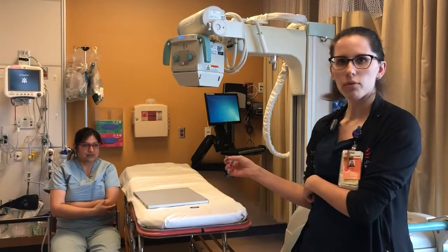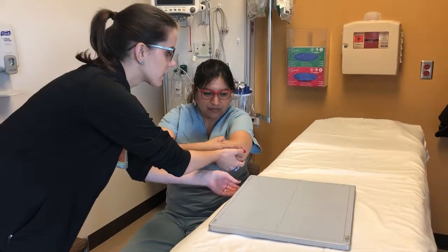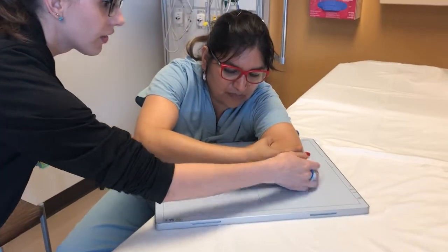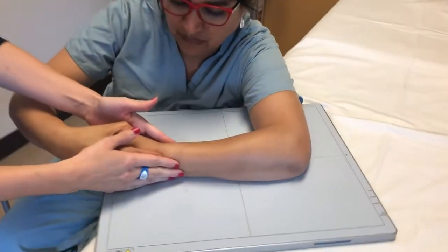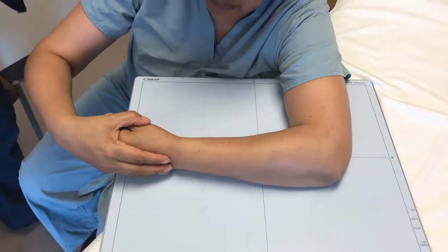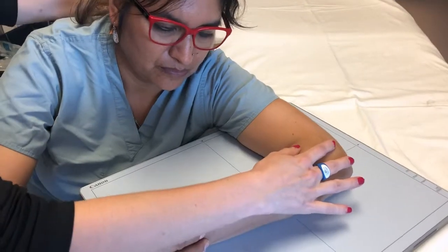So we'll start off with a lateral radiograph, and you come to your patient, talk to them, tell them we're going to ease your arm up on the cassette, and you can easily change the orientation of the cassette to them. Perfect. So we have it on the cassette, and we're going to take their other arm and hold their wrist and make sure that they roll that wrist just in a lateral position, making sure the radius and ulna are superimposed here. The important part too is to make sure that they drop that shoulder a little bit. Make sure the shoulder and the elbow are in the same plane, and you can do that by bringing this forward a little bit, giving them more room to drop their shoulder.